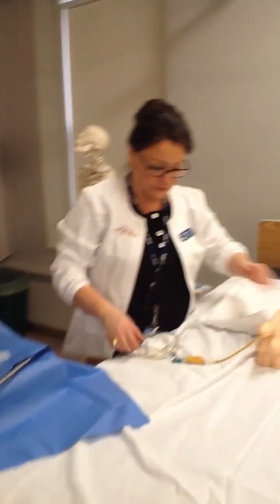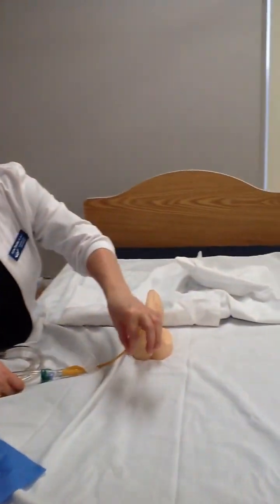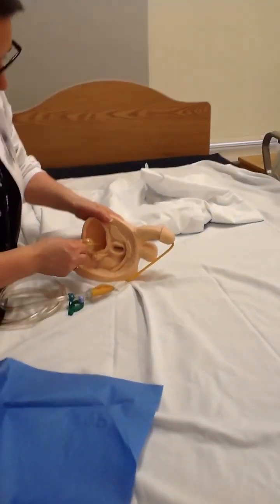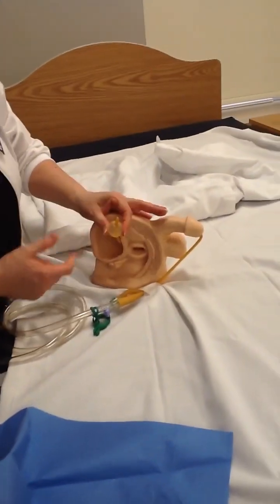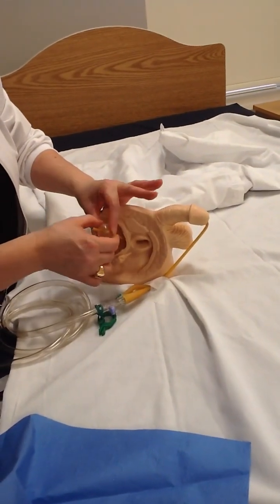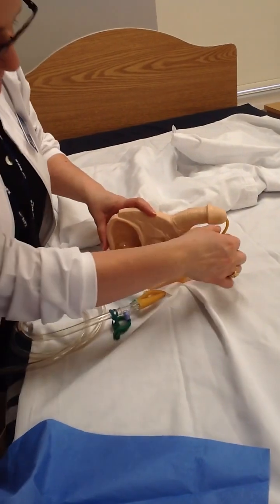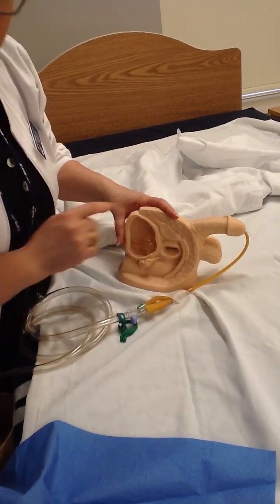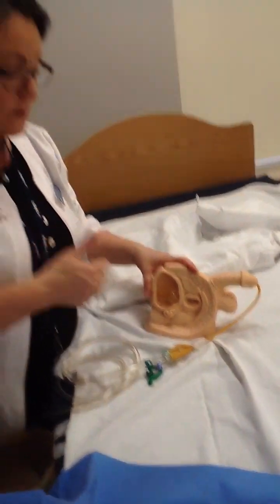And I just wanted to show you, now that the procedure is done, again, when I tell you to pull out on the catheter to make sure that the balloon has caught in the neck, this is what we want to see. So that's what 10 mils of sterile water look like, and when we snug that or pull on it, tug, we want it to catch in the neck of the bladder. That's how we know it's secured up there and it's safe in the bladder.